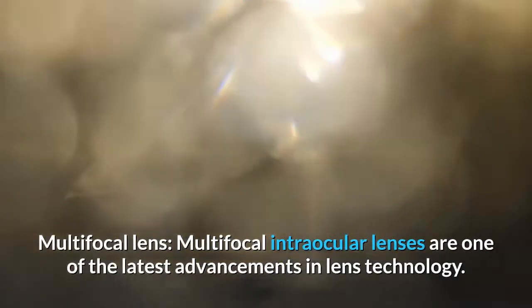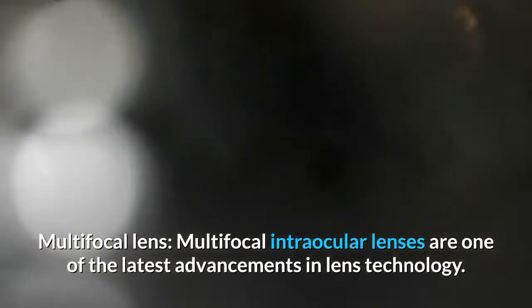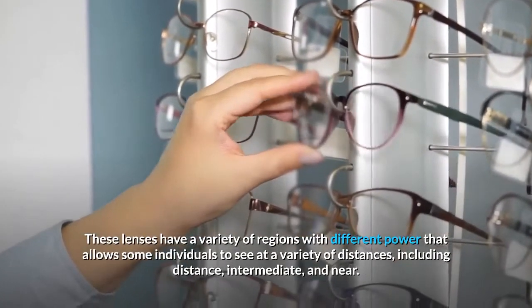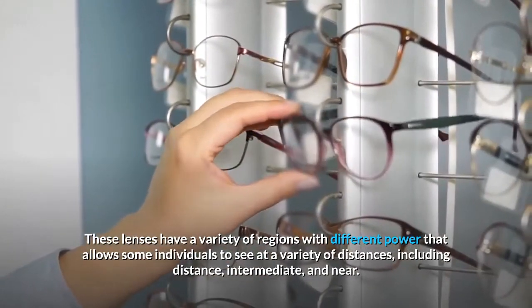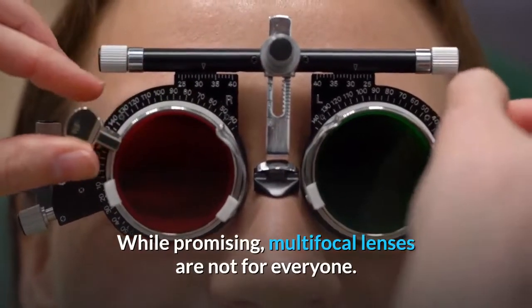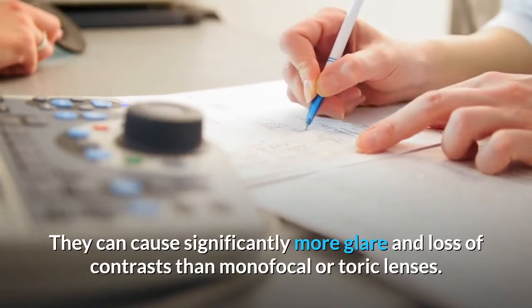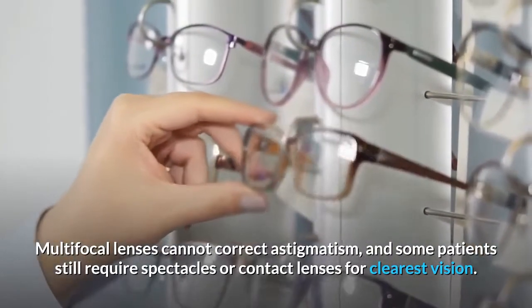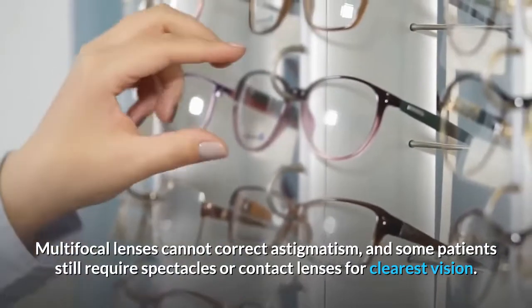Multifocal lens. Multifocal intraocular lenses are one of the latest advancements in lens technology. These lenses have a variety of regions with different power that allows some individuals to see at a variety of distances, including distance, intermediate, and near. While promising, multifocal lenses are not for everyone. They can cause significantly more glare and loss of contrast than monofocal or toric lenses. Multifocal lenses cannot correct astigmatism, and some patients still require spectacles or contact lenses for clearest vision.